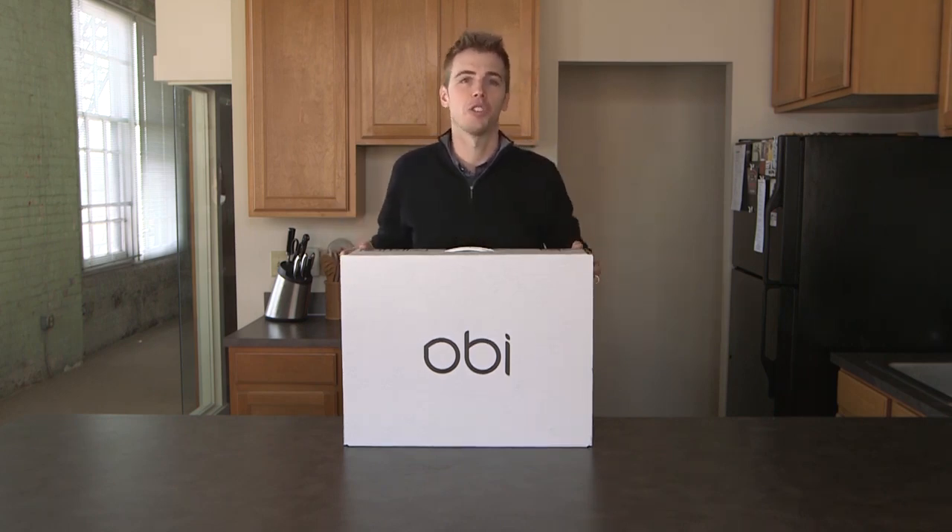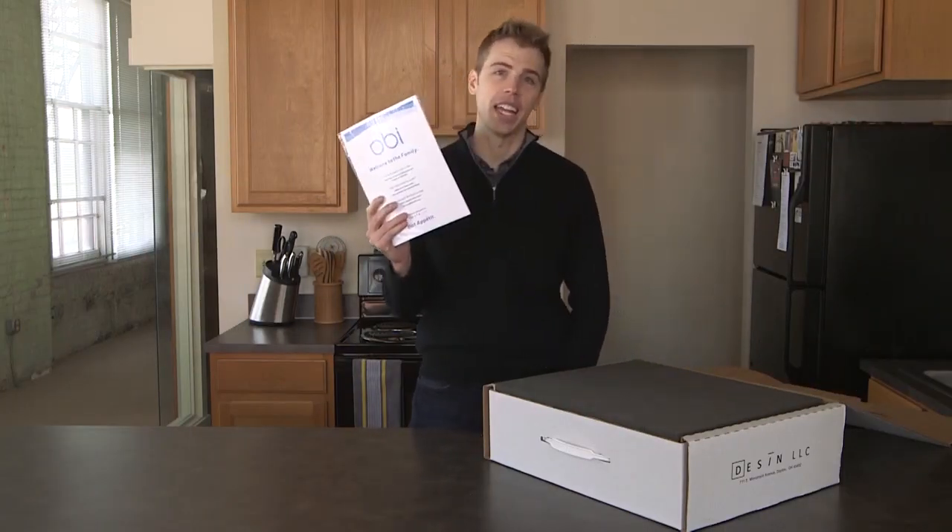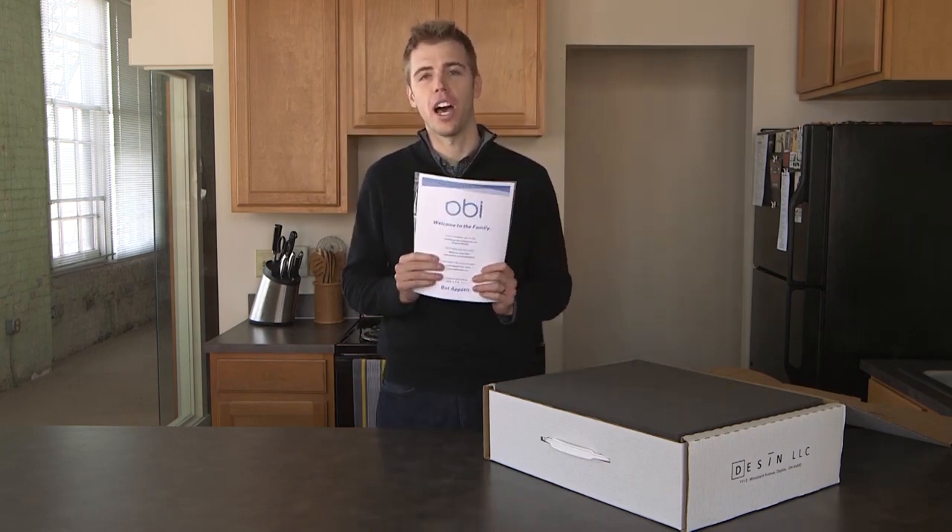Let's start by opening the box and exploring what's inside. The first thing you're going to notice is a packet. This contains three documents: a welcome sheet, a quick start guide, and a user's manual. Please ensure you read through all three documents before attempting to power on and eat with OB.